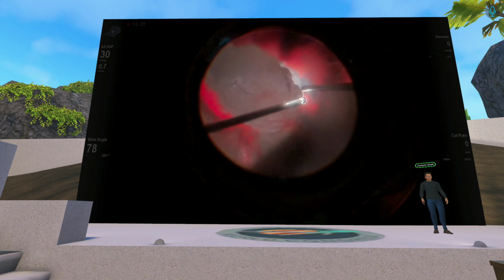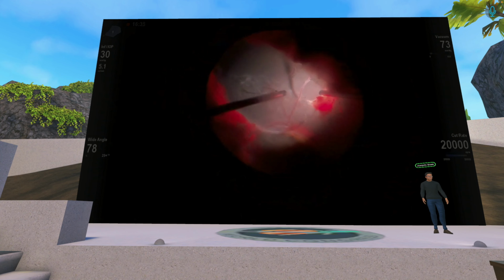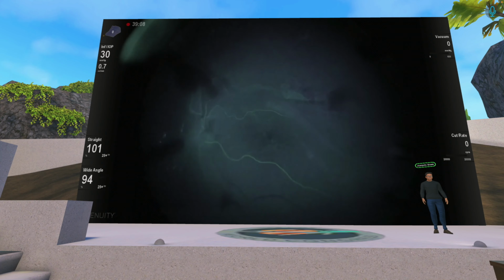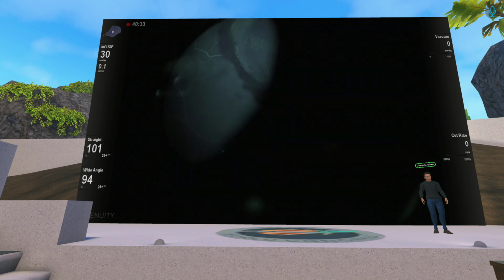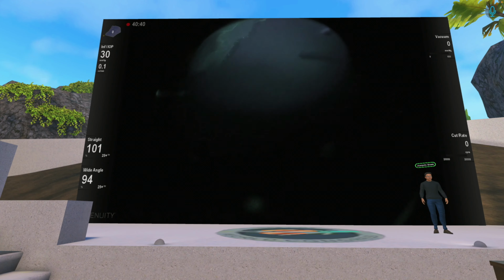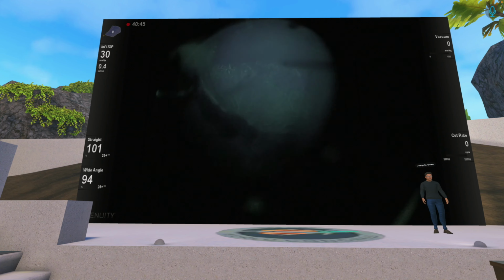Yeah, I 100% agree. And I think another indication for this is that in those diabetic patients, you can do intraoperative angiography and you can see the vascular profile of the macula, so that you can talk to the patient later and say, here, we took out the hemorrhage, but this is what you should expect later on if there's macular ischemia present. Yeah, exactly.